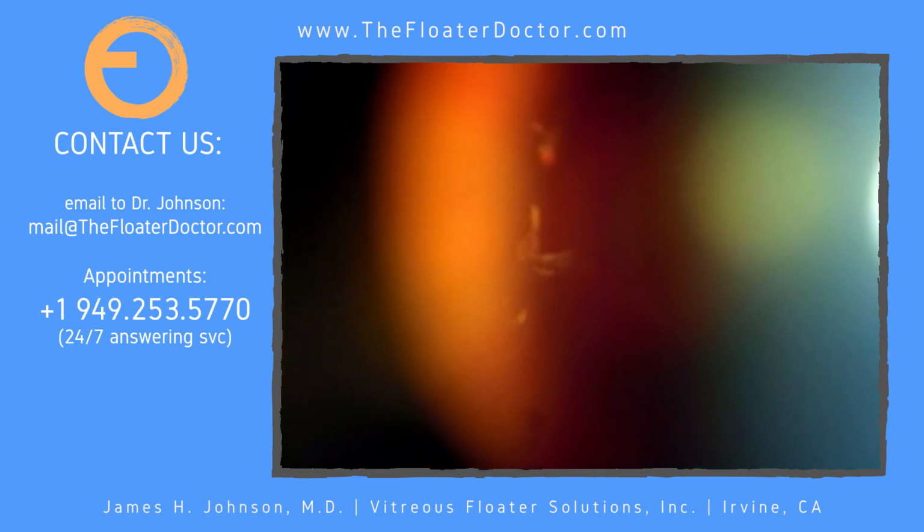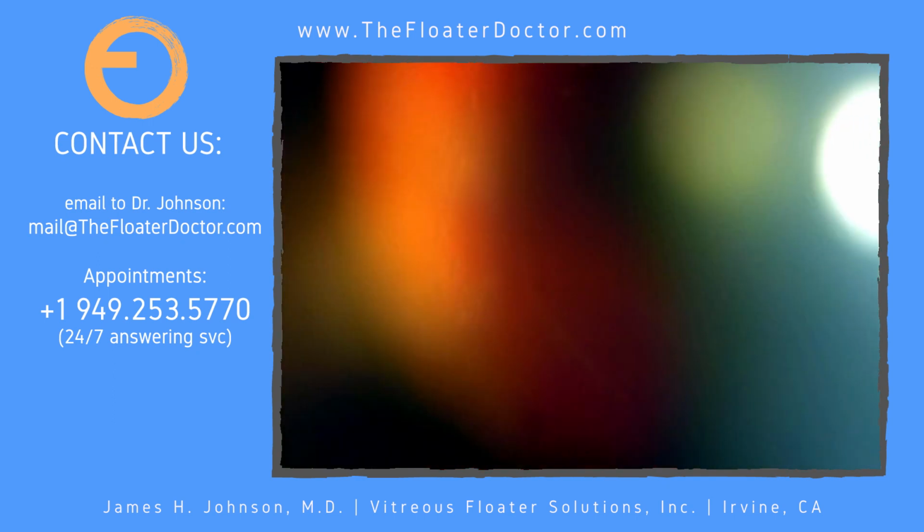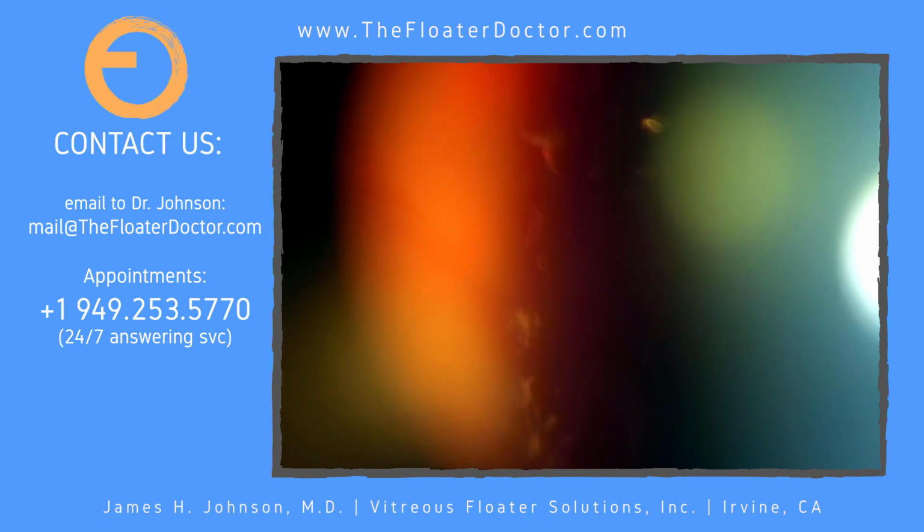Okay, there we go. Okay, look down, way up high, back down again, back to light here.